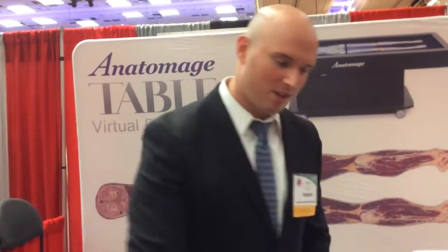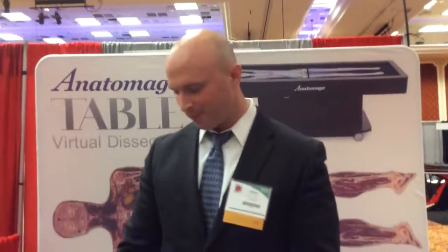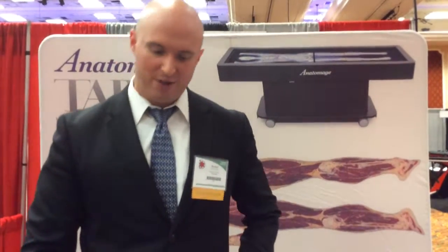Now I could see this would be really interesting if you could somehow flip this table to face the class if you were teaching anatomy. So you can hook it up to projectors. Yeah. We have display ports here, so if you wanted to do that, you can. You can certainly hook it up to other sources. And that would look on the screen just the way it looks on the table here. Exactly. That's fantastic.